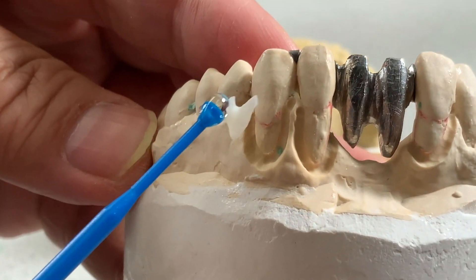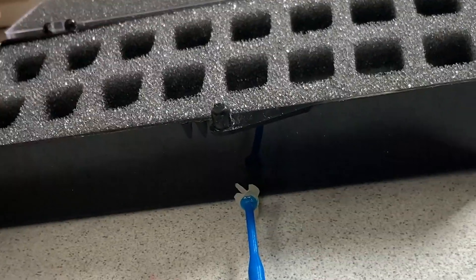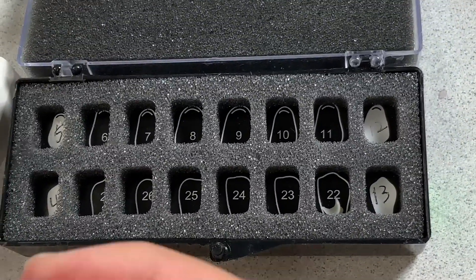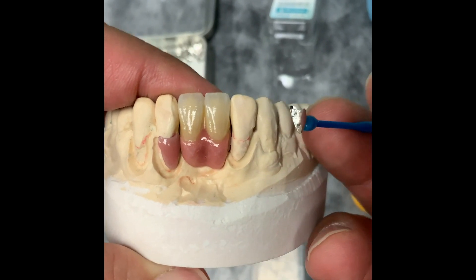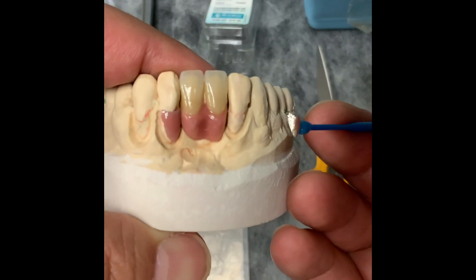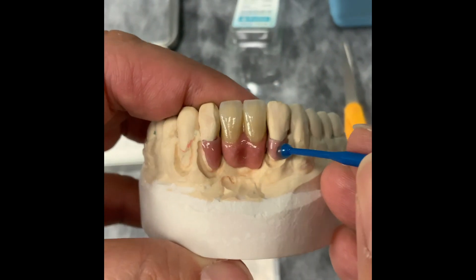Each one is unique with the ceramic area, covering the gingival recession. We made this nice frame design. We'll make it beautiful with stain, then bond and cement it for the old cervical area which is dark. This is very unique. I'm going to put down the numbers — this one is number 22, and 26. We turn the saddle so I can put it in here. This is the platinum foil technique.